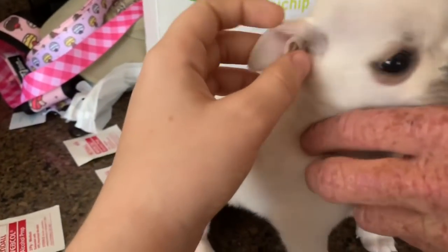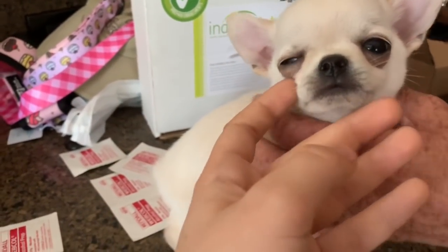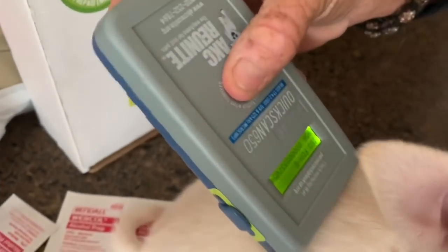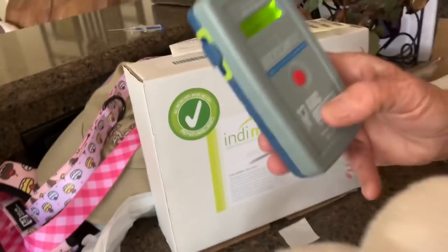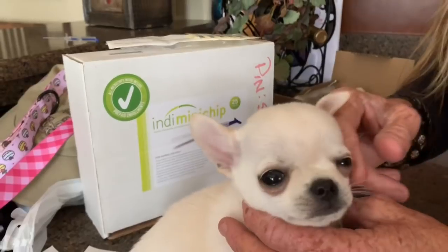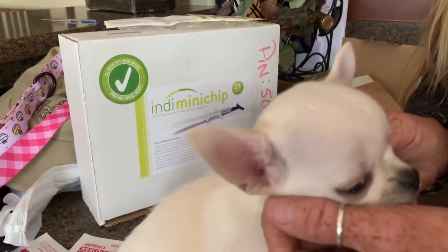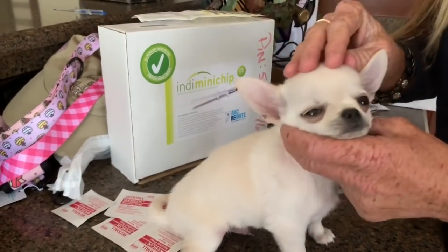They will be sore for a little bit — like anybody is after a needle. You don't want to mess with their little backs after you do it. For a day they might be uncomfortable. After we have this done, we're going to read the microchip again to make sure that it is, in fact, in his skin and not stuck in the needle. It is in him. He's got another week or so before he goes home, maybe even a little bit longer, but we will definitely check this microchip one more time before he goes home to make sure it hasn't come out, because that can happen.